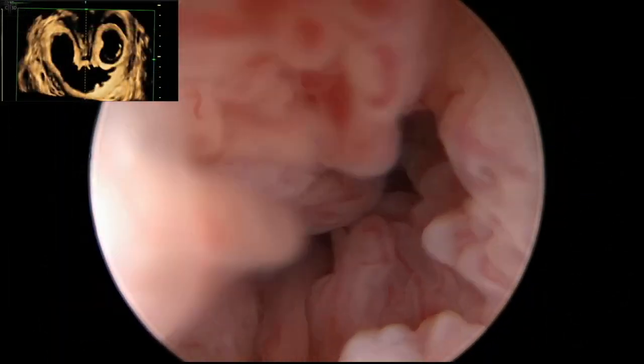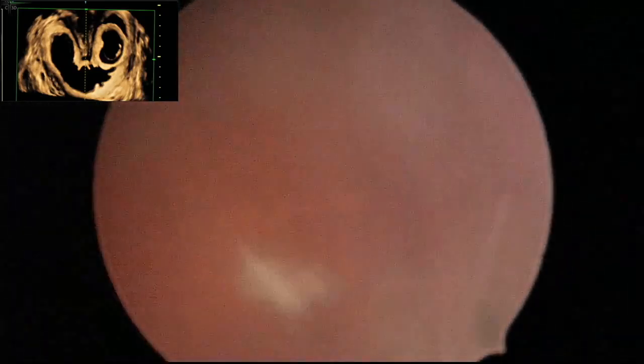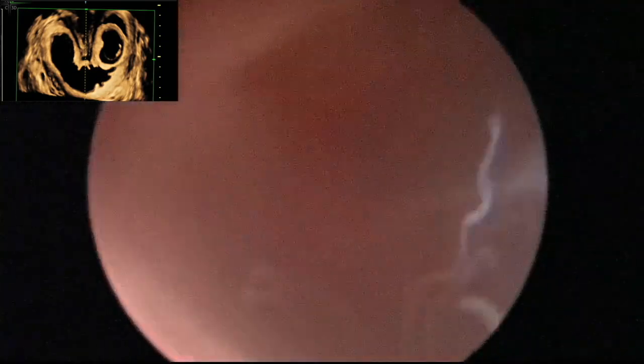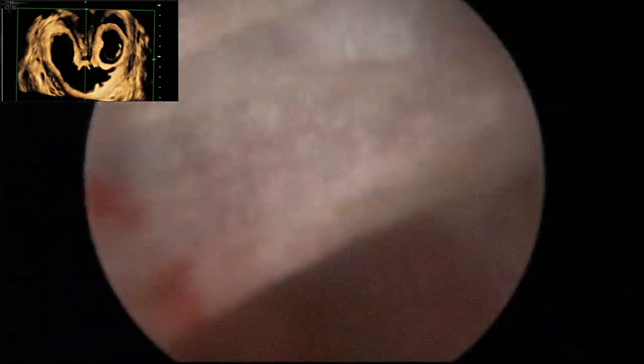Diagnostic hysteroscopy under regional anesthesia was performed using a 5 mm continuous flow hysteroscope with a 30-degree optic. Upon entering the uterine cavity, a partial septum arising from the uterine fundus and extending down to the lower third of the uterine cavity was noted. The gestational sac was identified in the left hemic cavity; the right hemic cavity was noted to be empty.